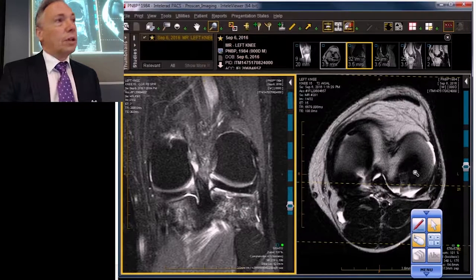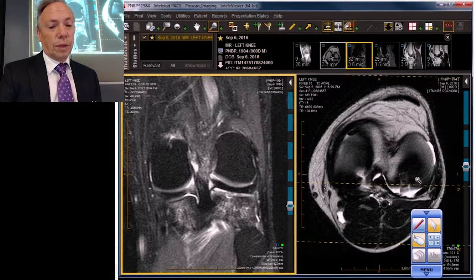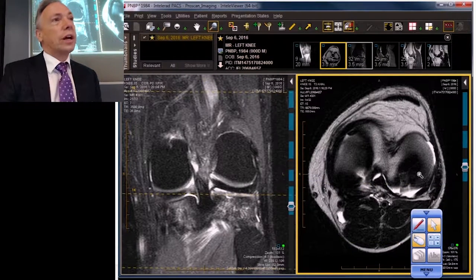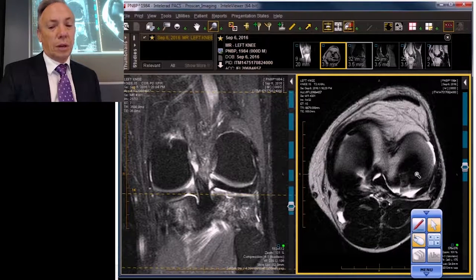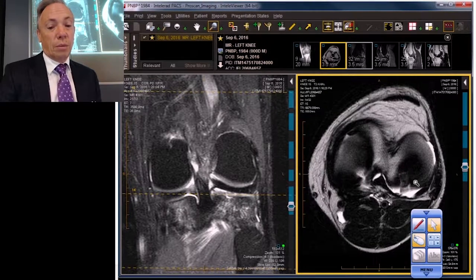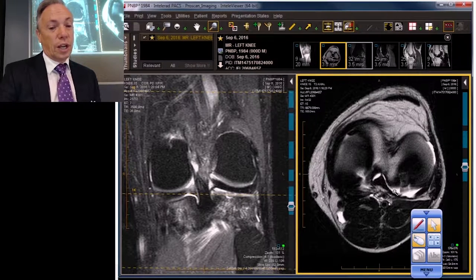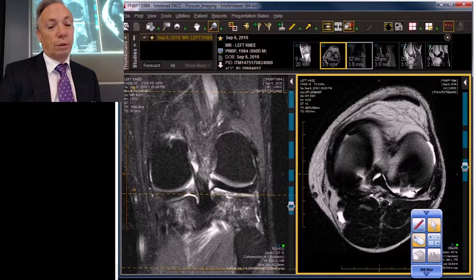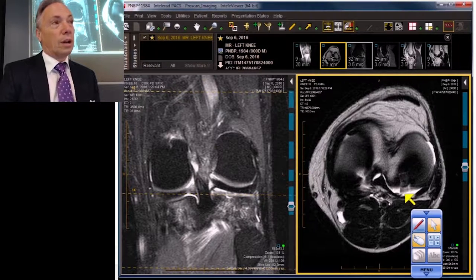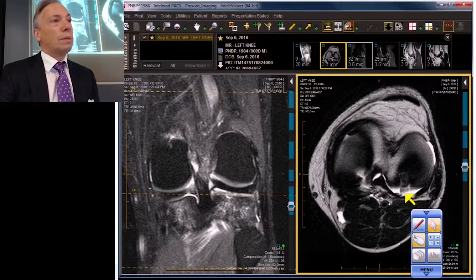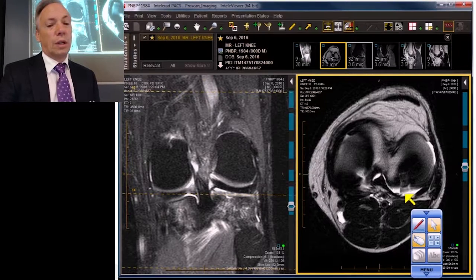Often underutilized is the axial projection, and when you scroll thin section axials — less than two millimeters — you can pick up a lot of information. For instance, you can see a problem with the bone on the lateral side, which correlates with this fracture or osteochondral fracture on the lateral side. You also see distension of the posterolateral meniscal capsular reflection by fluid, which already tells you that you probably have had some type of pivot shift related insult.